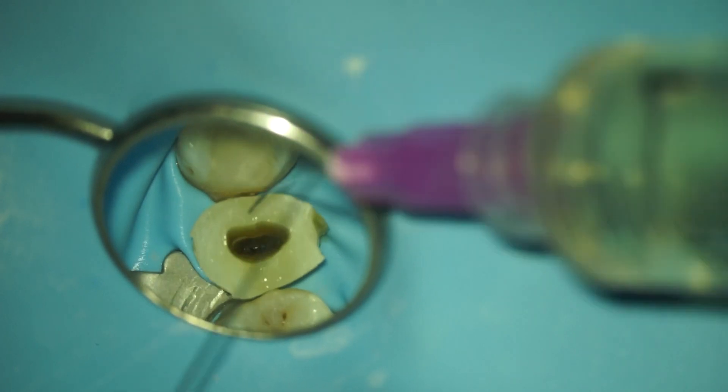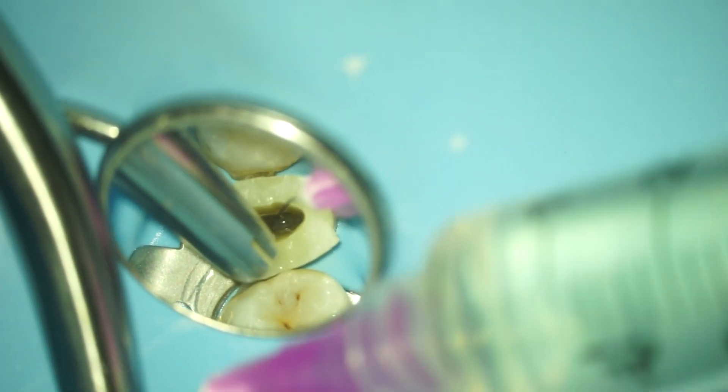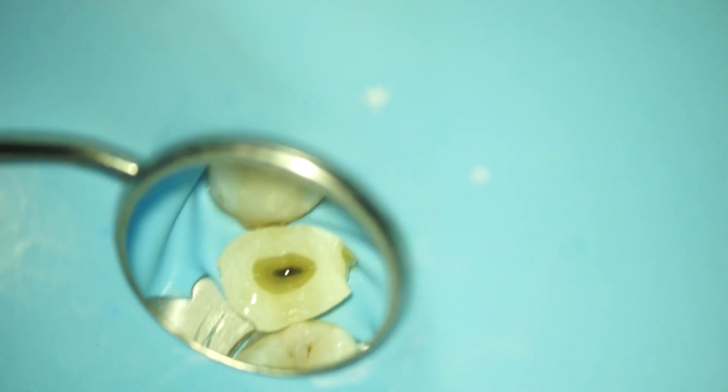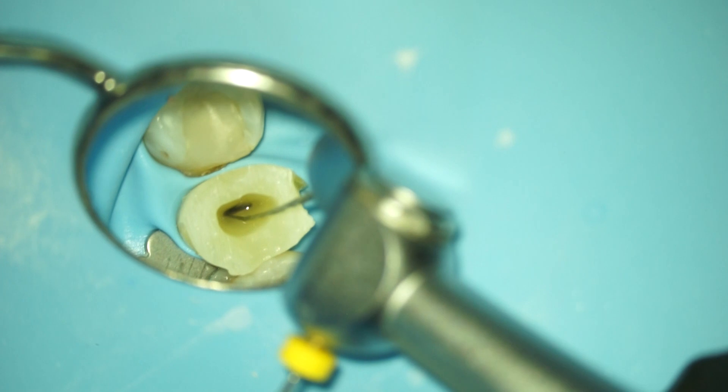Here you can see why endodontists are the best lovers in dentistry — we have extremely well-developed tactile control. Then of course some more rinsing, because rinsing is basically the most important part of root canal treatment. Here I start using the path glider, which is basically the path file from Comet.